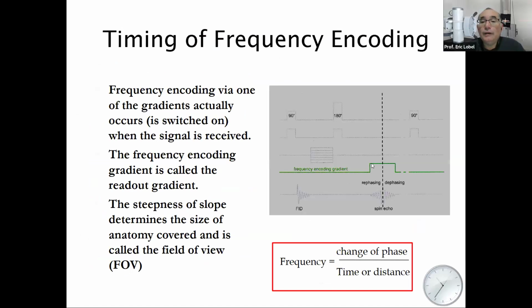What this is here is kind of representative of our bandwidth. So if we have a broad receiver bandwidth, we're getting this entire signal, which includes a lot of noise at the ends. So you might be thinking, why can't I go super narrow and just focus on this one peak in the middle? It's because we need to get a little bit more information than that, right? But it is adjustable.